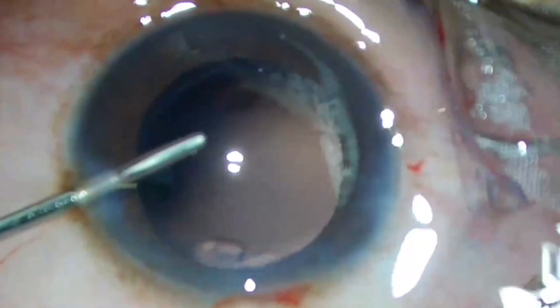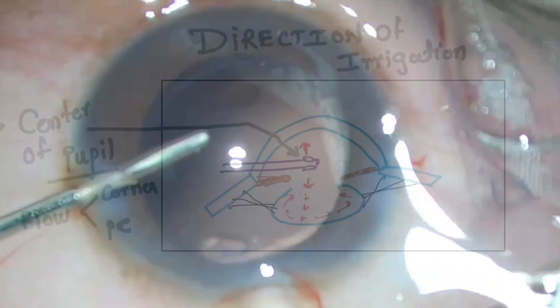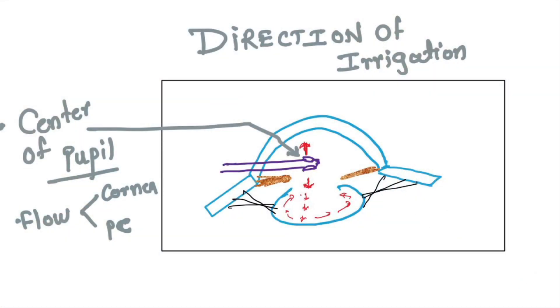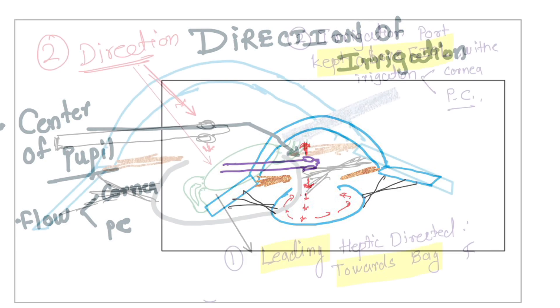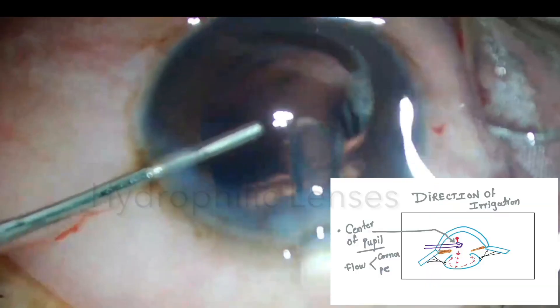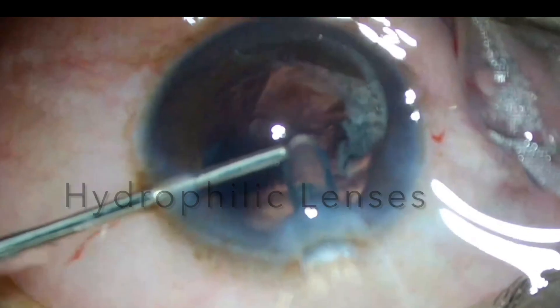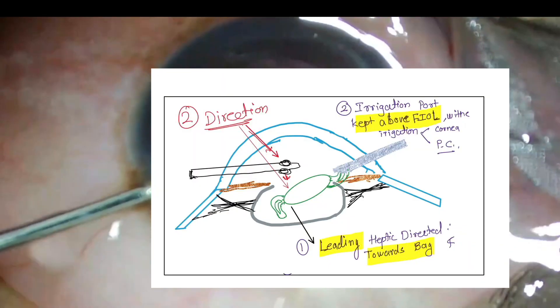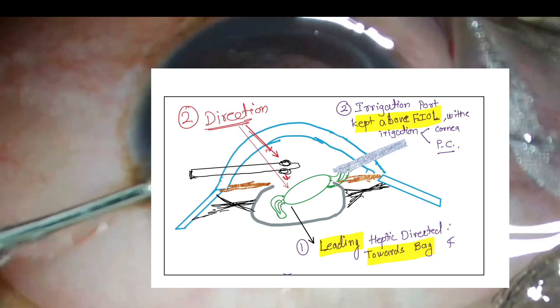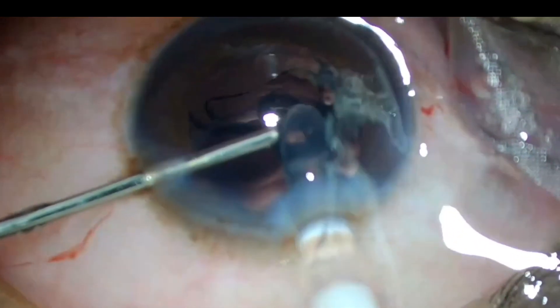The irrigation cannula is passed halfway to the pupil through the side port. One opening of the cannula is directed towards the cornea and the other towards the posterior capsule, inflating the anterior chamber. The IOL cartridge is then inserted through the tunnel. As you can watch, the IOL is being inserted gently into the anterior chamber.